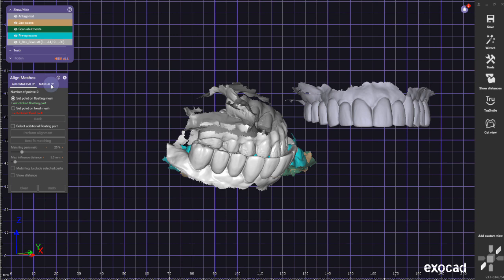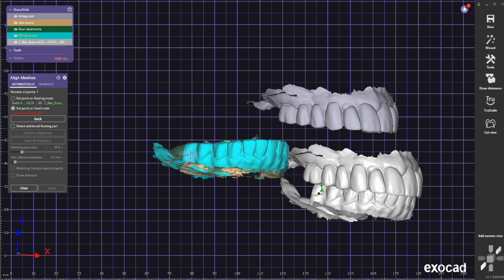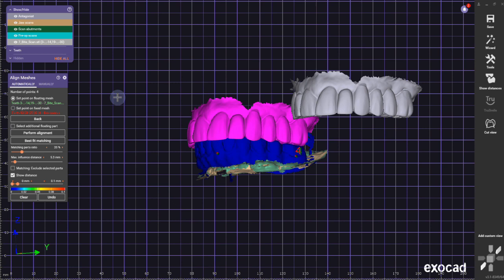So here I'm going to go to align meshes, move the bite scan first out of the way so I have good view on everything, and now I start aligning it. The important thing is again find reference points—find enough reference points so you can have a good alignment—best fit matching, I get out here.